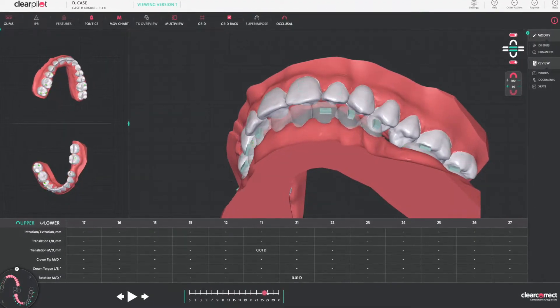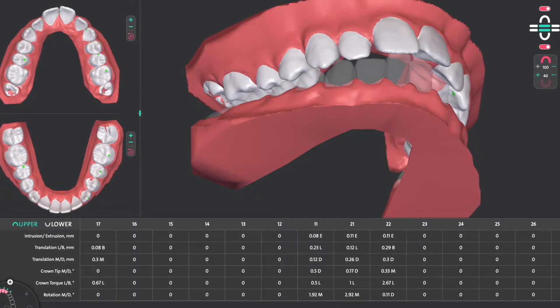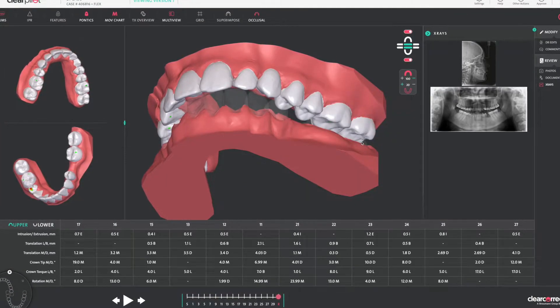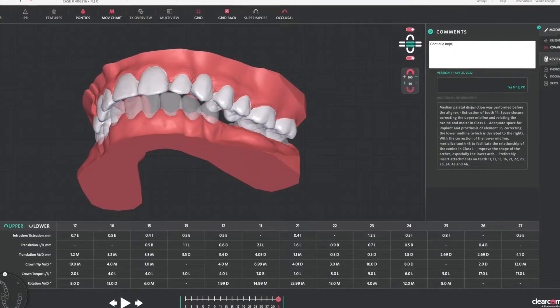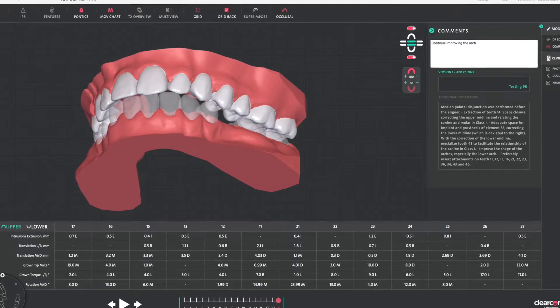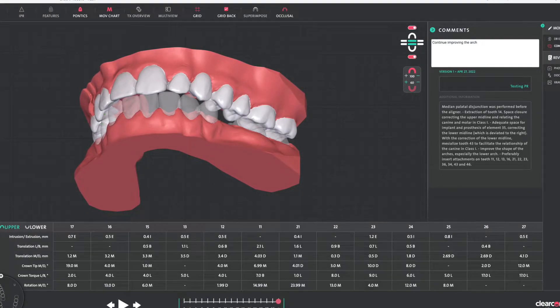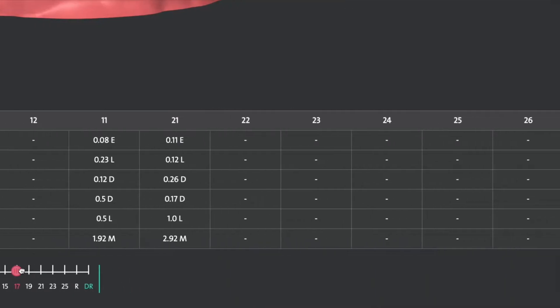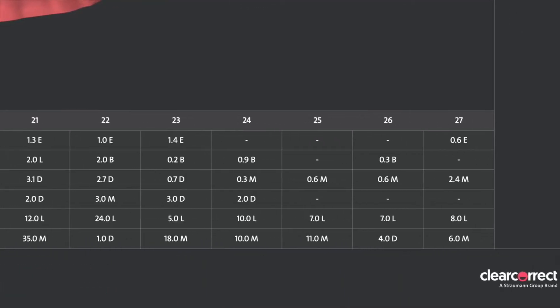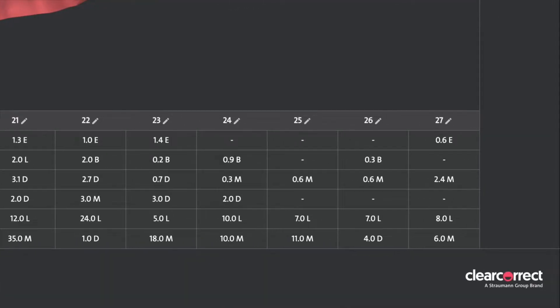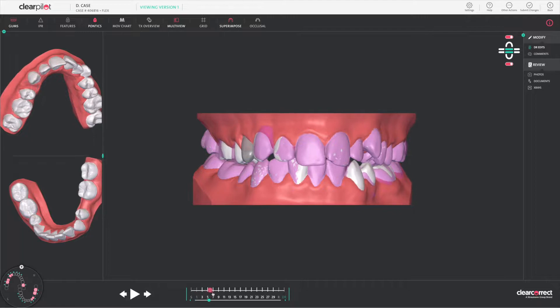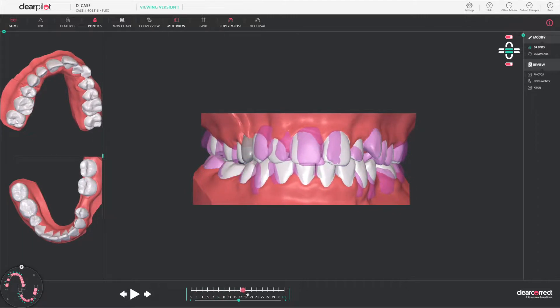ClearPilot's 3D visual interface is packed with ways to view and customize your patient's case so you can effectively evaluate their dentition and plan their treatment. With ClearPilot you can view details on position and movement for each tooth while visually comparing any step of treatment to the starting position.